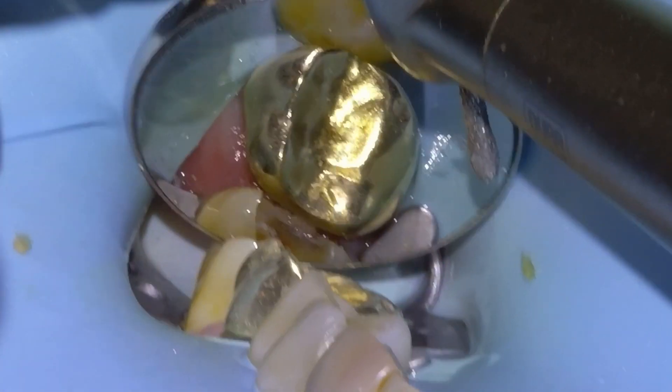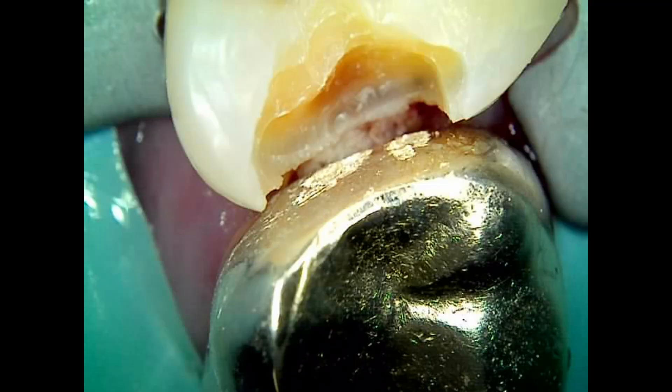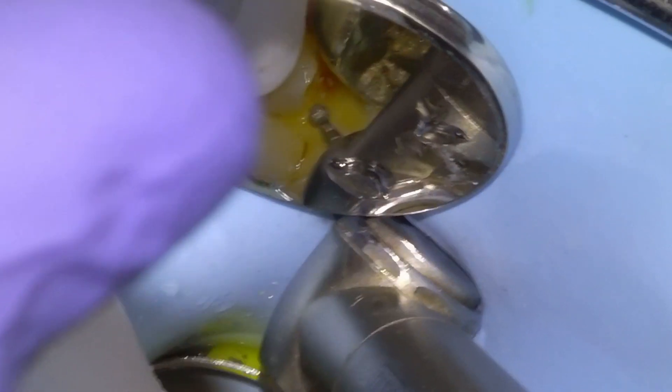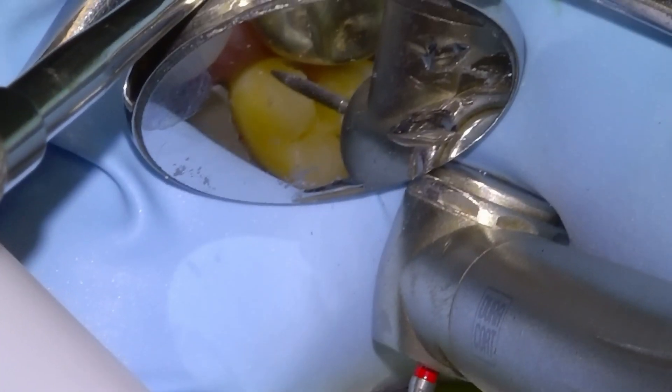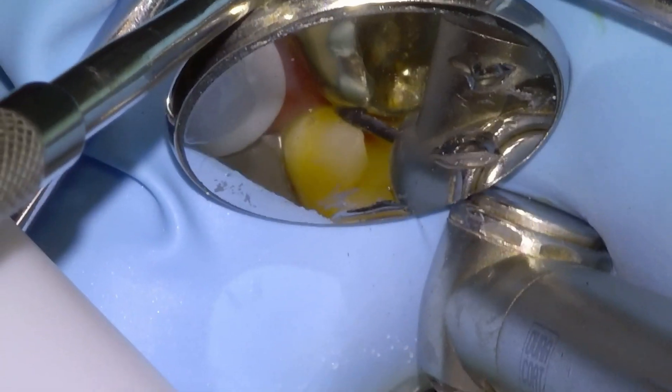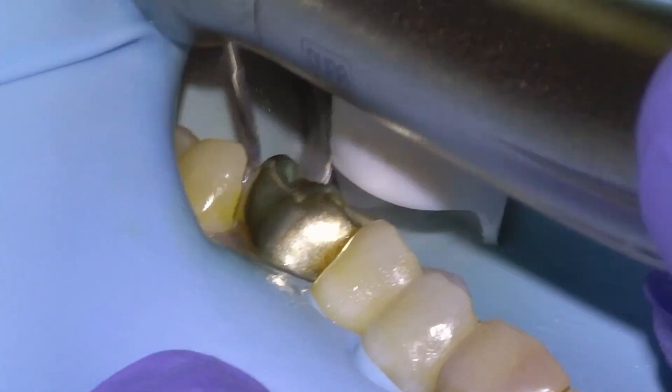We'll open it up a little bit more so it's easier to get our matrix band on. And once our box is pretty much finished, we just want to refine the sharp edges of the internal surfaces of the prep with a large round diamond burr. I usually use a high speed for the last burr to touch the tooth before etching because I think it gives a bit of a cleaner smear layer than a slow speed. And then just remove any unsupported enamel in the proximal contacts with a flame burr.